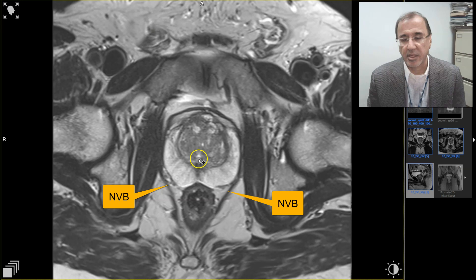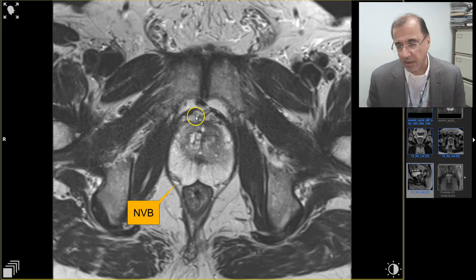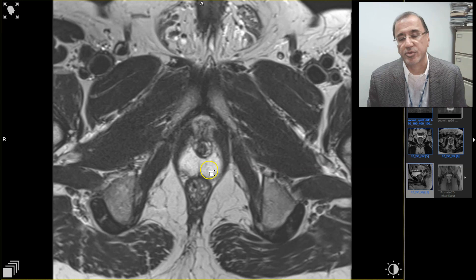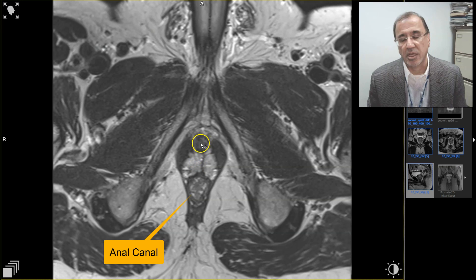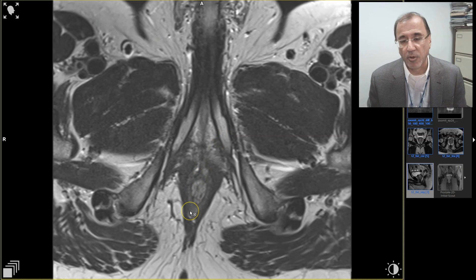Going more caudally, there's the verumontanum taking on that V-shape, the transition zone, peripheral zone. Here are the periprostatic veins. Towards the apex of the gland, we go past the transition zone. Here is the peripheral zone, the anal canal, and then the prostatic and then bulbar urethra before going into the penile urethra. These are the corpora.